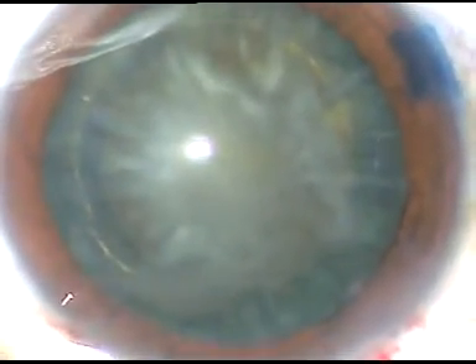Now, hydrodissection is to be done. You must see the fluid wave going from one side to the other side. Hydro delineation is also done. In this case, hydro delineation has produced a beautiful golden ring.